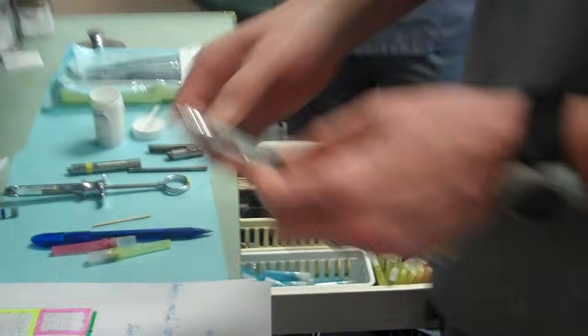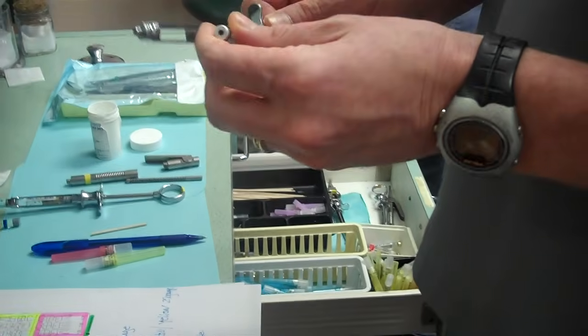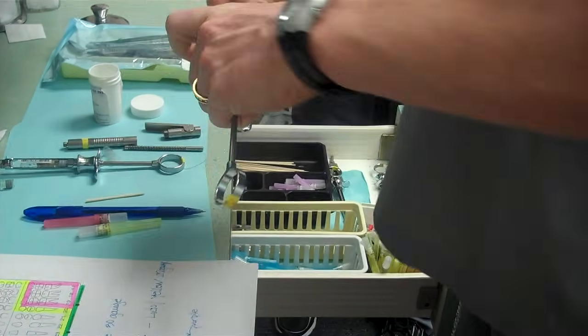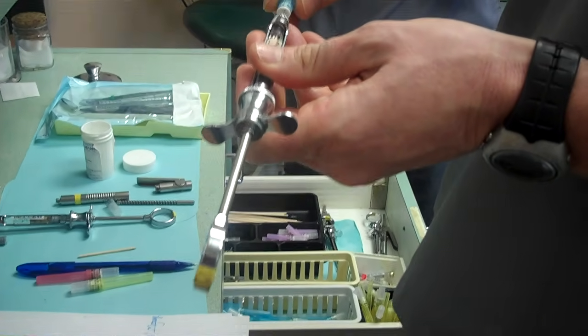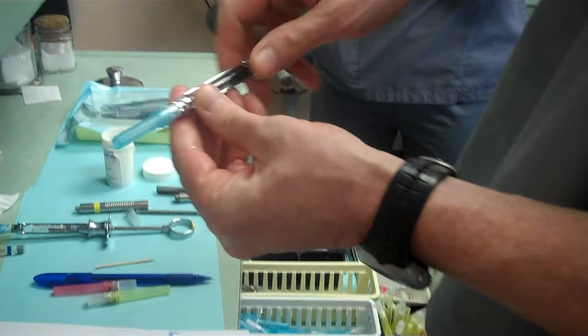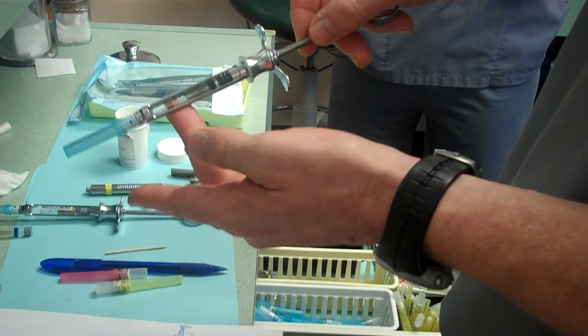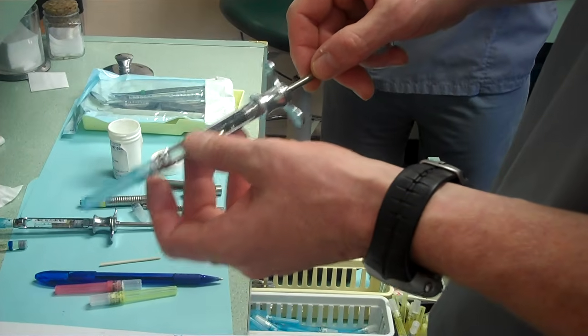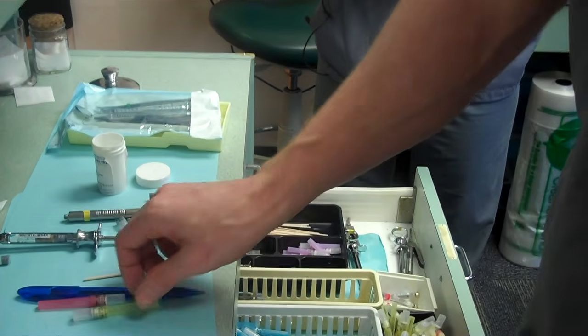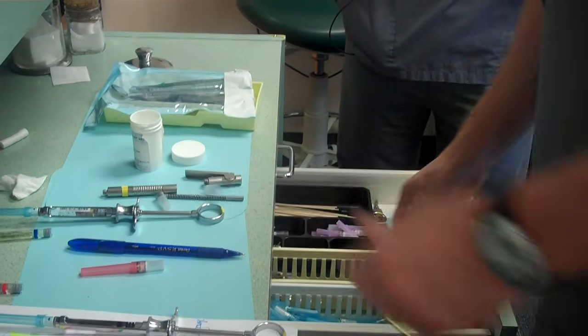The block is a little more complicated. For maximum comfort, typically I will give a pre-block anesthetic. So we're going to numb the area in the back with Citanest Plain. The reason we use Citanest Plain is because it's a neutral pH and it's non-burning and it doesn't sting. And then immediately I follow that up with lidocaine.